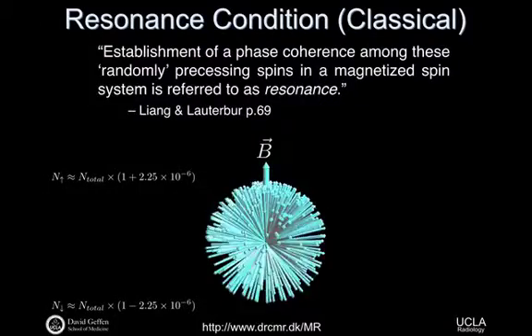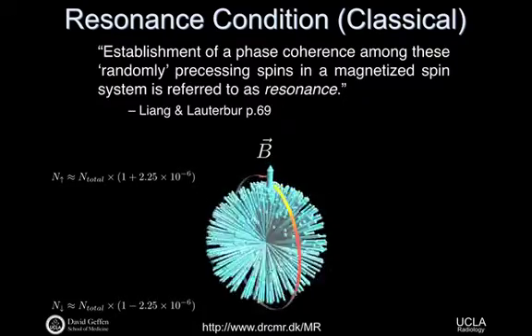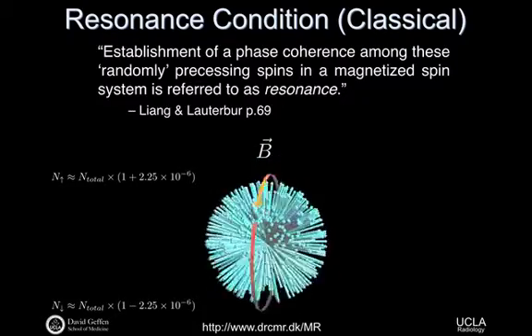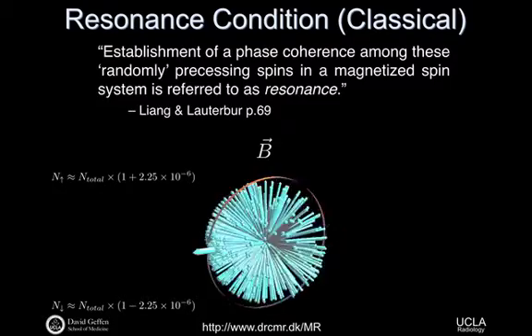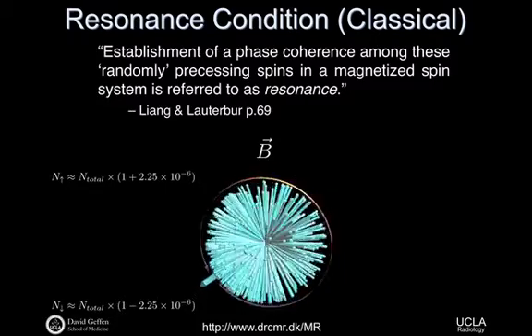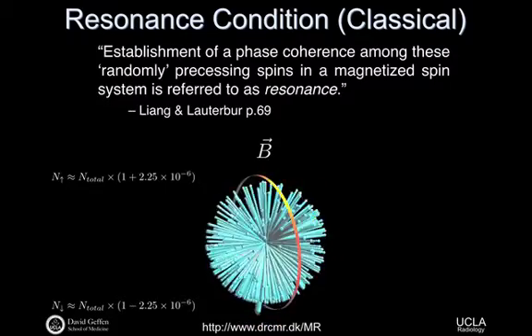Through the application of a B1 pulse, this thing is precessing because it's in a B0 field. When I start acting on it with a B1 pulse, I can start tipping over my bulk magnetization. This is very similar to the diagram I showed you before of that spiraling down of the bulk magnetization, right? And in this case, he's showing the spiraling down all the way to the state of inversion.